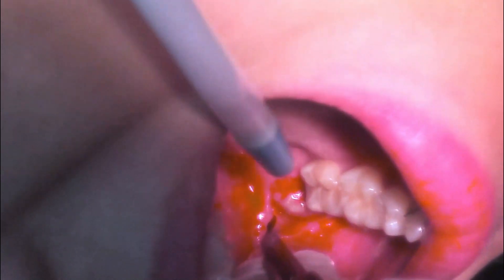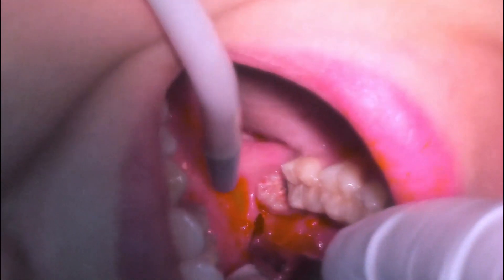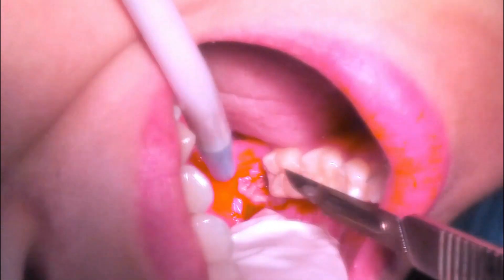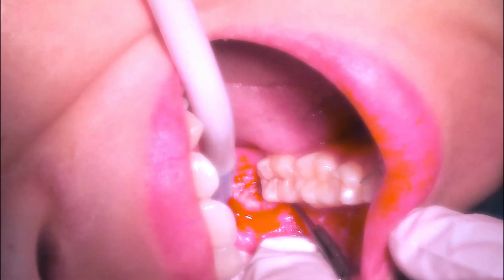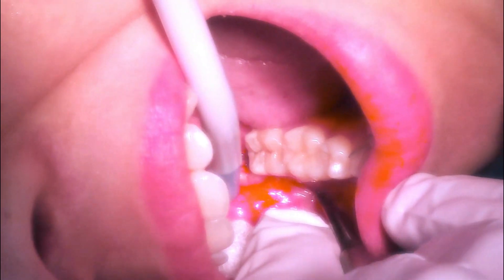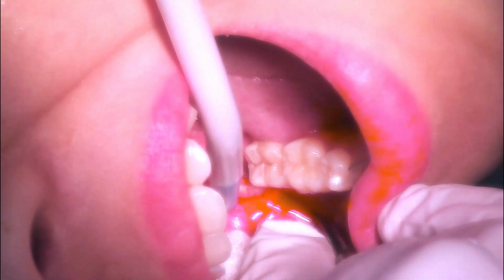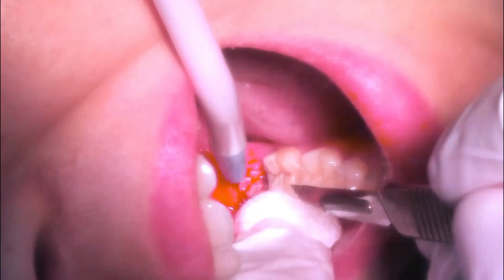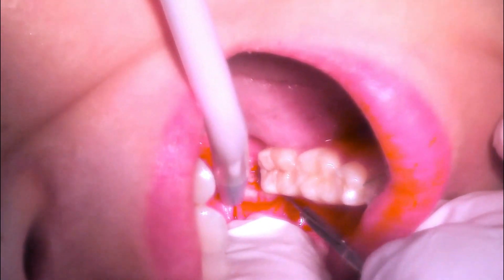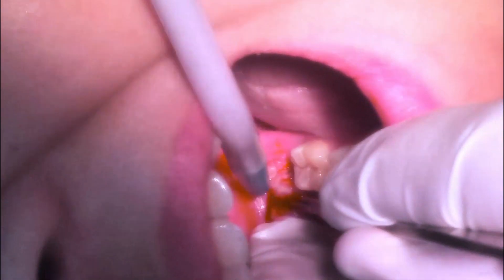The incision usually starts from the distobuccal incision. You need to keep it very buccal, otherwise there is a chance of damaging the lingual nerve. I also prefer to give a vertical release incision mesially so that the flap can be closed passively after surgery.